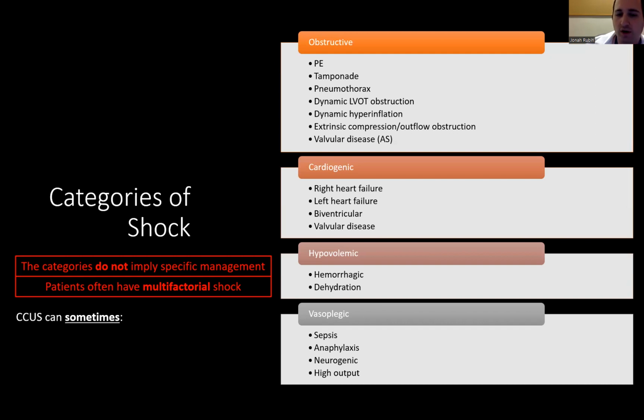Where ultrasound can help you is that sometimes it can help you straight up diagnose the cause of shock. This is particularly true for basic echo, where you're going through the basic windows that we've mostly focused on for this entire year, where you put a probe on a patient and you get a subcostal view and you see that clearly the patient is in tamponade. Or you put on a probe and you see a blown RV and a clot in transit, and you know that you have a PE. And that's really nice. It's not so common, right? As many of us probably feel and are familiar with, it's not so common that you put on a probe and you've gone from undifferentiated shock to a diagnosis and you know exactly what your next step is.